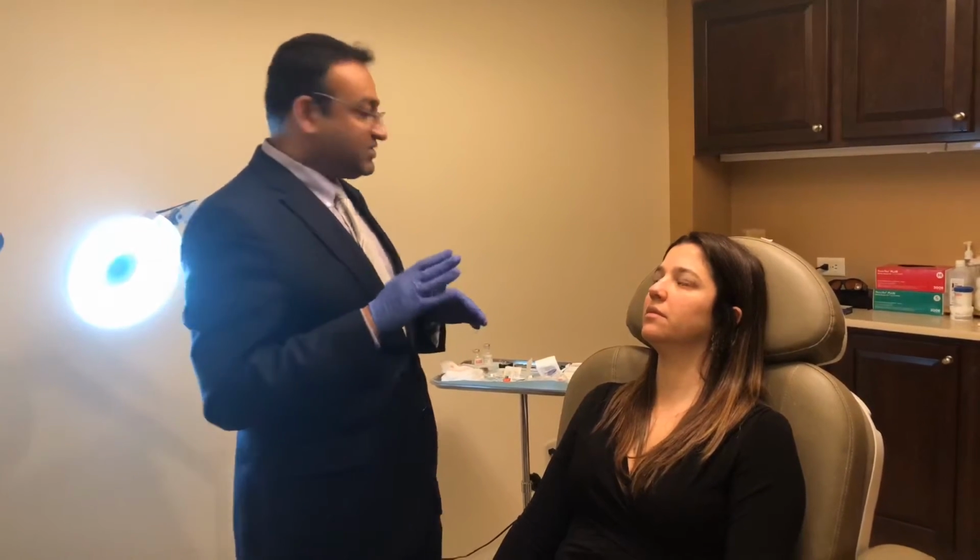Today we're going to be using a product called Restylane. It's regular Restylane. The reason I like using Restylane is because it doesn't attract as much water as some of the other hyaluronic acid fillers. Tends to minimize the swelling and really produces some nice results.